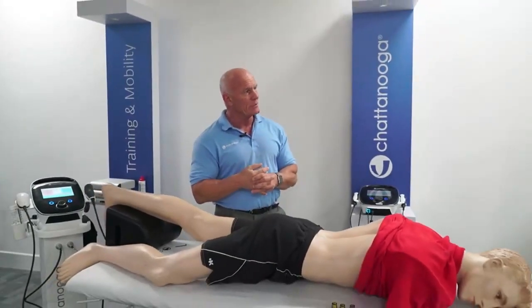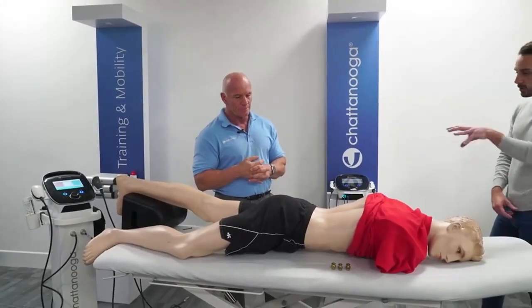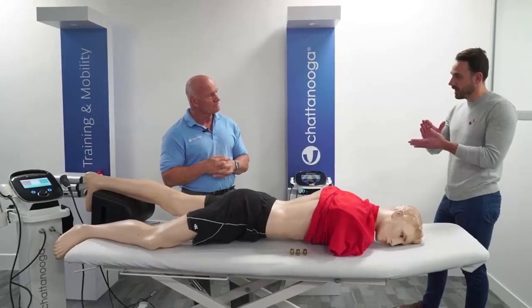And when you're putting it on the patient, does it have, like the old machine, a feature where it gradually increases the pressure?